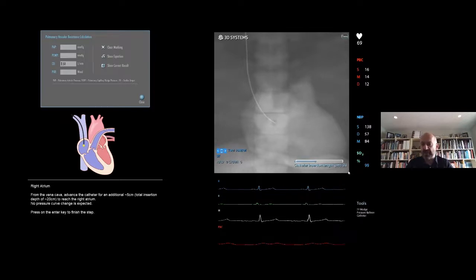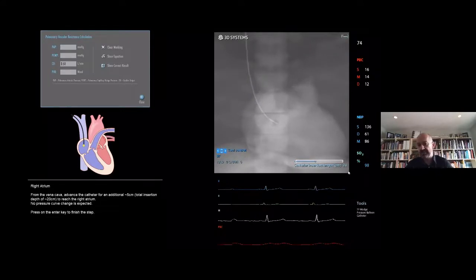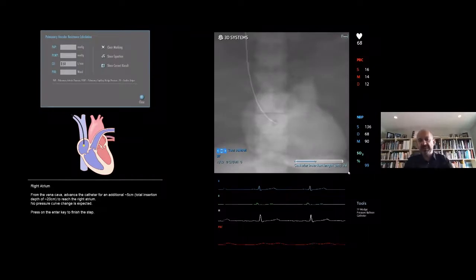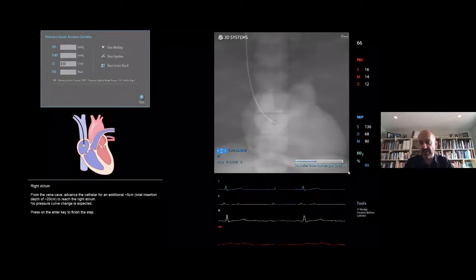So it's good to stop here for a second, take a deep breath and see where you're at. So 24 centimeters, that's about right. Pressure is the RA pressure. It is usually low, as in this model, anywhere between 5 and 15. Anything higher than that, you're clearly having some pathology at this point.